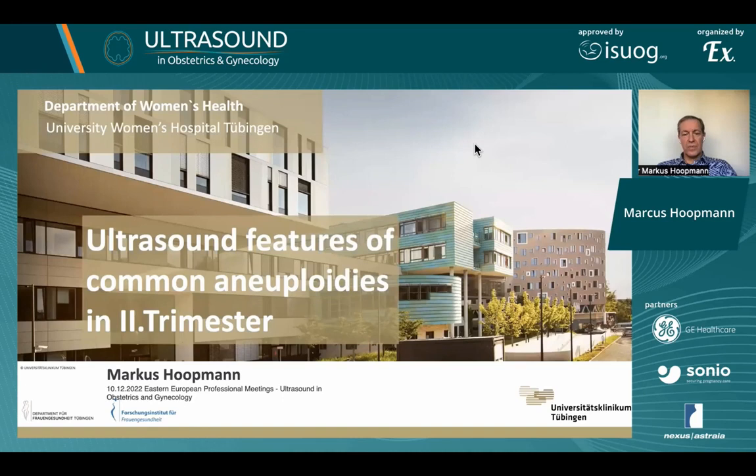Dear colleagues, dear chairman, I'm very proud and honored to present ultrasound features of common chromosomal aberrations in the second trimester. This is really a classic in prenatal medicine. I think it's 20 years ago that I first heard about the genetic scan in the second trimester in a lecture.